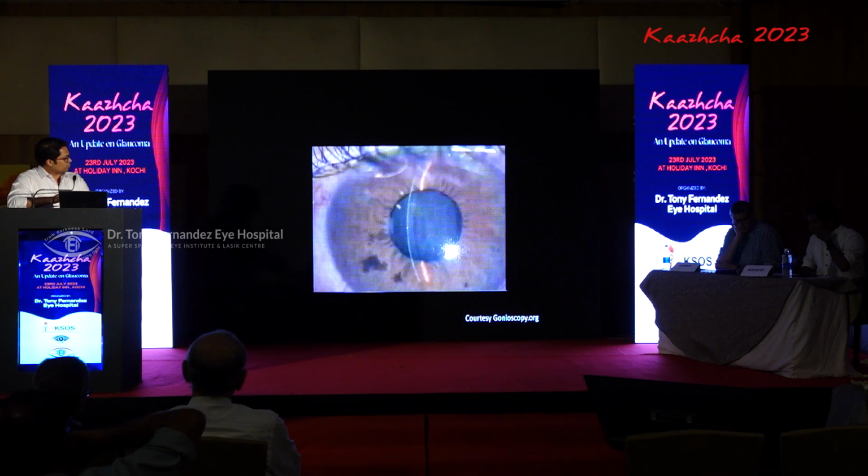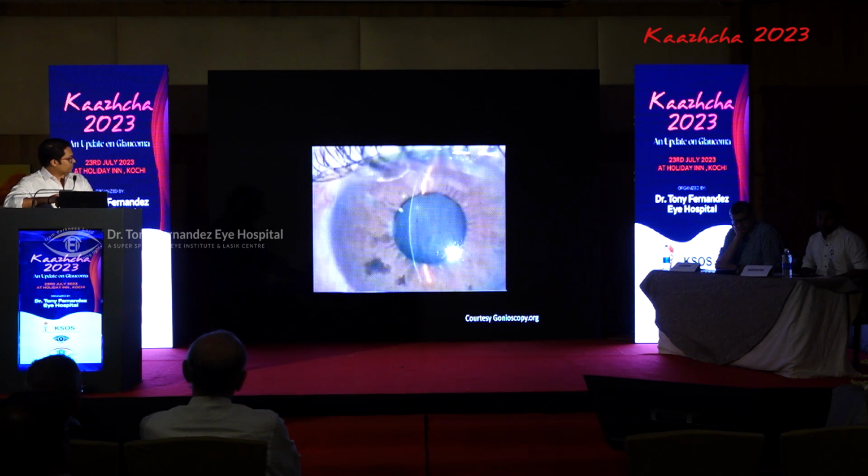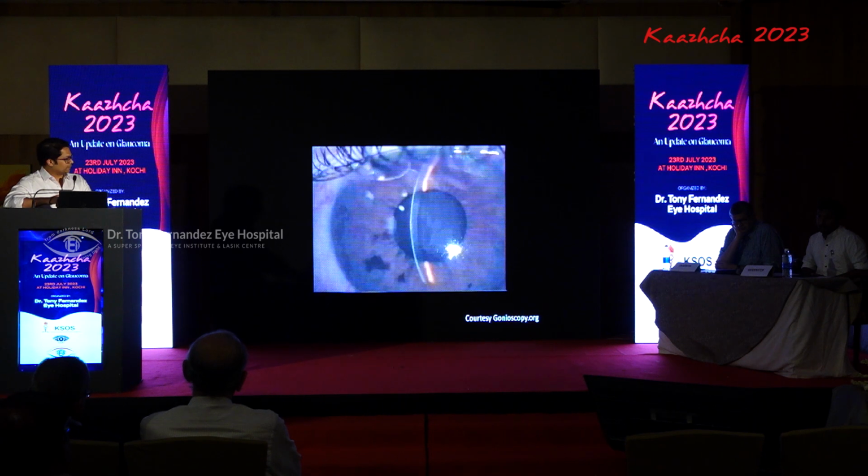So here you can see a post-incisional surgery with malignant glaucoma, aqueous misdirection syndrome. The peripheral AC, or rather outside the pupillary area, the entire iridocorneal area is in contact, and there is a small central slit-like AC in the pupillary region. So post atropinizing the eye, the AC will be formed.